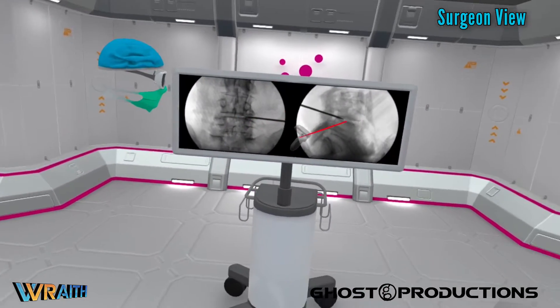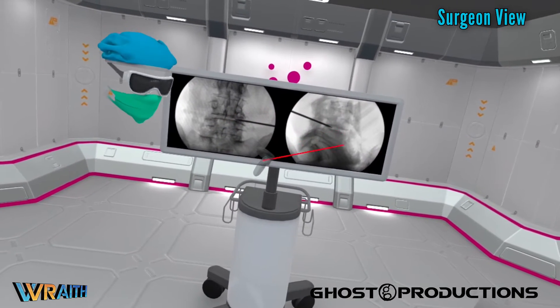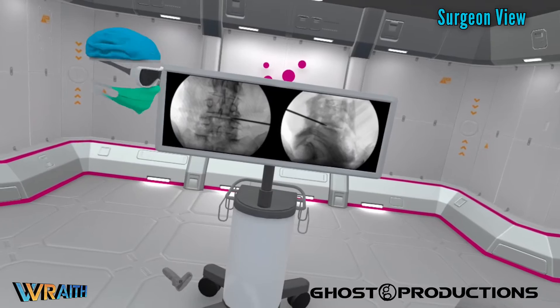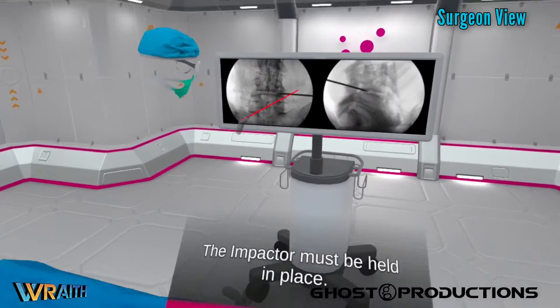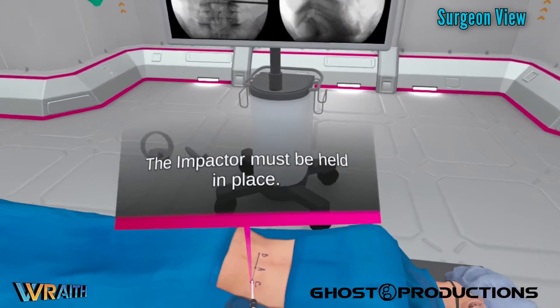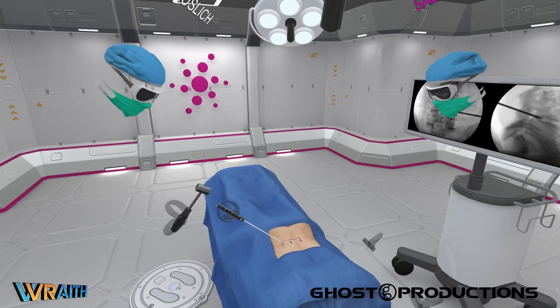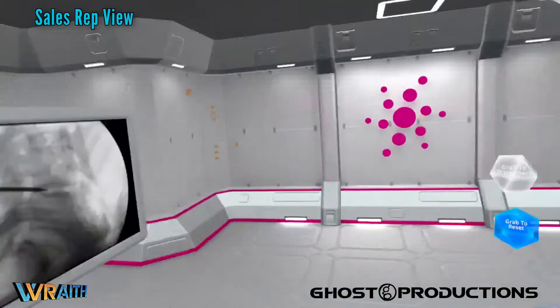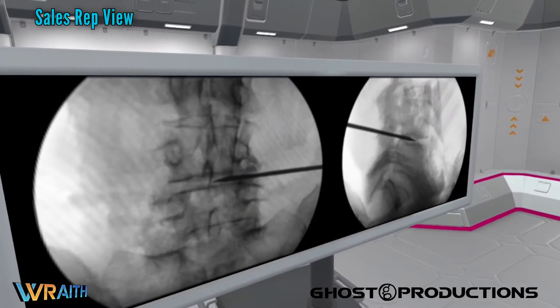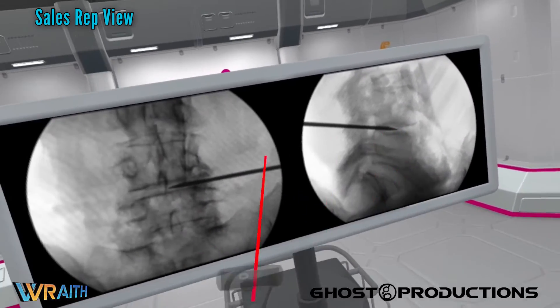How hard do I hit this thing? You can give it a couple of medium taps to get through the initial part of the annulus. Confirm with fluoro — you can see now we're about five millimeters into the disc space. We're going to make another advancement with the neural probe; we want it to be about midline of the disc space. Your taps can be a little lighter as we're now into the nucleus of the disc space. Confirmation on fluoro — that looks great, right about the midline of the disc space.